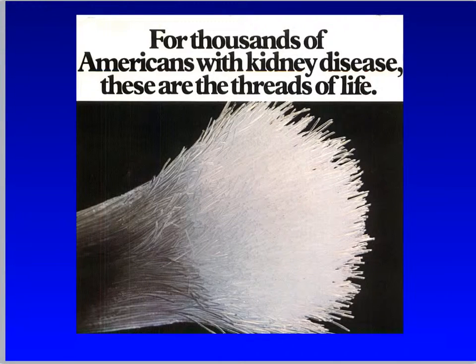Although the very first dialysis membranes were flat and about the size of a coffee table, current dialyzers achieve more surface area in a compact space by being made in the form of capillary-like hollow fibers with fenestrations along their entire length. The patient's blood flows through the capillaries, and dialysate solution flows past the outsides of the fibers.